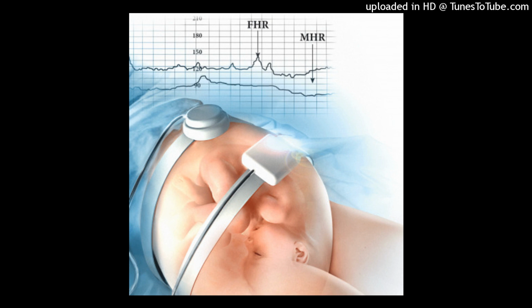Modern labor and delivery units may have wireless monitoring systems that transmit data to a base station for interpretation. Wireless systems allow patients the opportunity to ambulate in labor and can be used in water. External FHR is obtained by Doppler, also known as ultrasound, and UA is acquired by a tokodynamometer, TOCO.